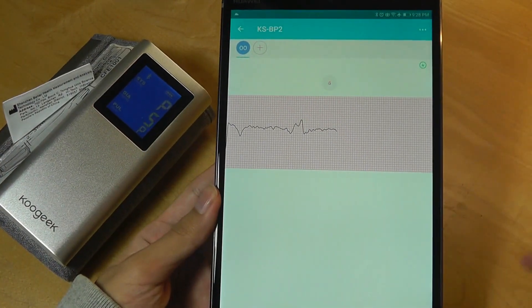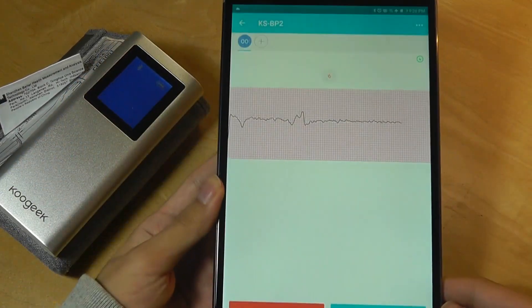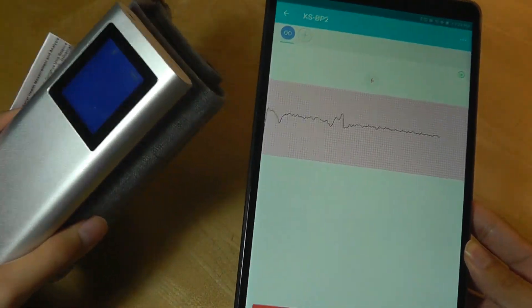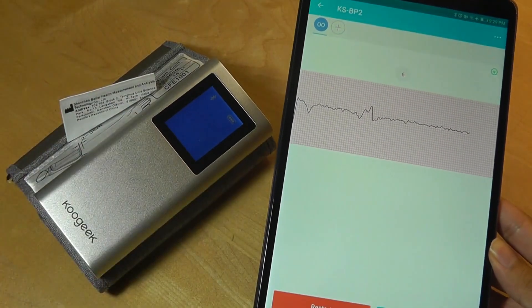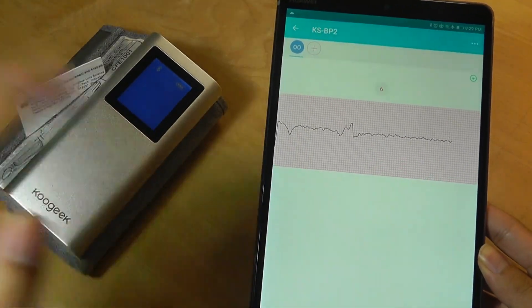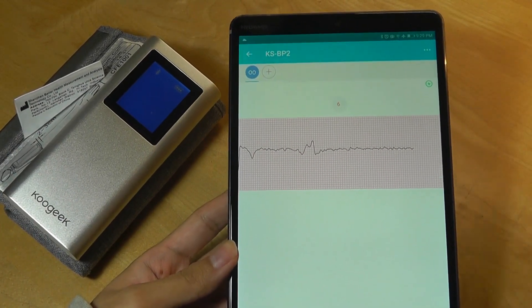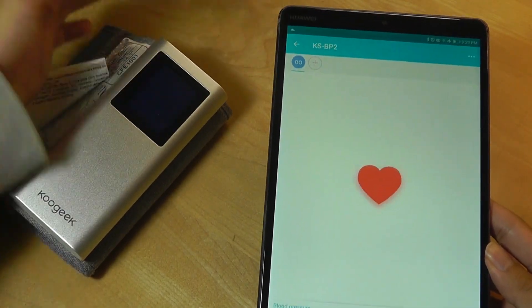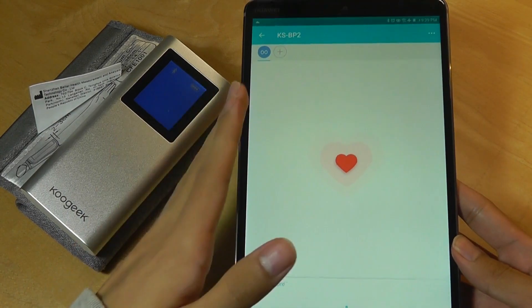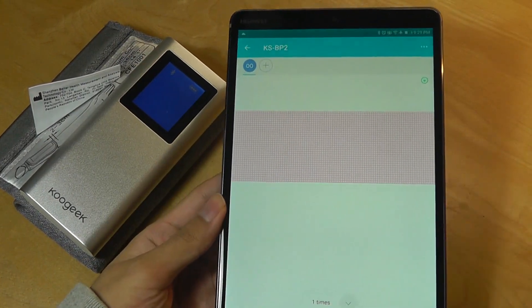You also get a cardiograph that shows your heart rate information in real time, and you can also stop it from the tablet. The biggest downside I found in testing is that it times out very quickly — maybe by default to save on battery. After about 10 seconds of inactivity, the monitor just goes to sleep, and sometimes in those 10 seconds you're unable to connect using Bluetooth or Wi-Fi. If that fails, you have to tap the power key multiple times to try and reconnect. There's no option in settings to change the timeout duration, which is the only software downside.